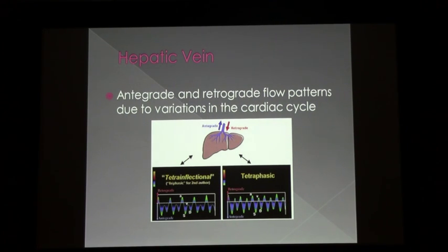I would say to you, no. So the other thing is, if there's any question, always just write flow is towards the liver. Everybody can understand that. It's not that I don't think you guys know what you're talking about, but if somebody else picked it up, they would say, was that fugal or pedal? I can't remember that. It's kind of like antegrade.